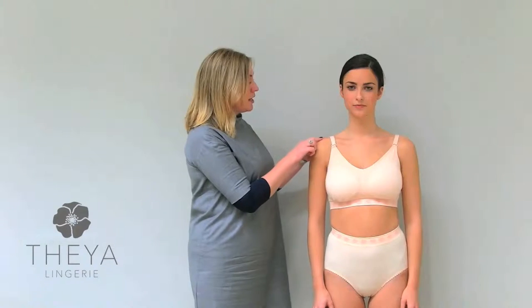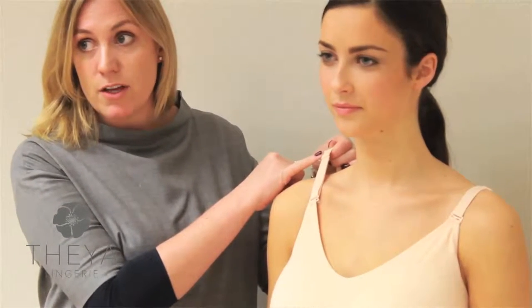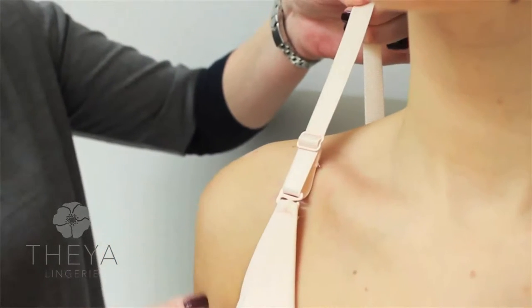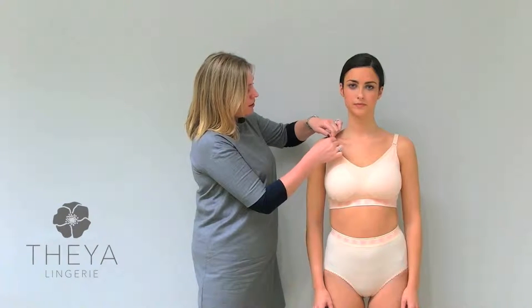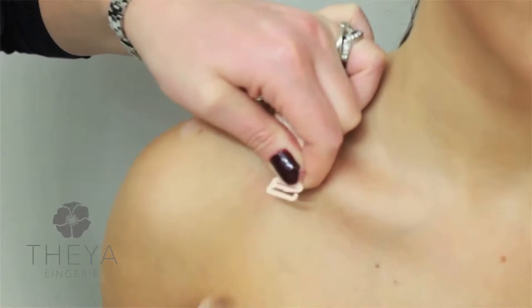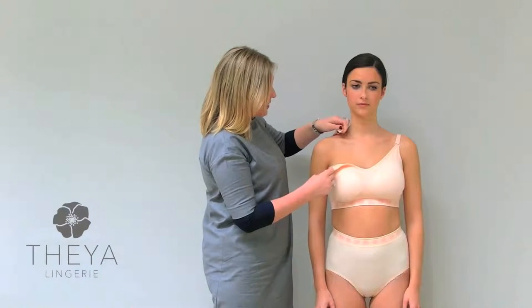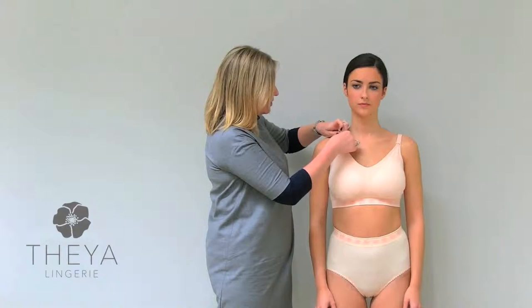Aoife here is wearing our Fleur Bra from our recovery range, so I'm just going to bring you through the benefits and features of it. Starting with the straps — they are front adjustable for ease of use, because sometimes after breast surgery you don't have much movement in your arms. You can also open them at the front, which is good for when in hospital or if you are having radiotherapy.